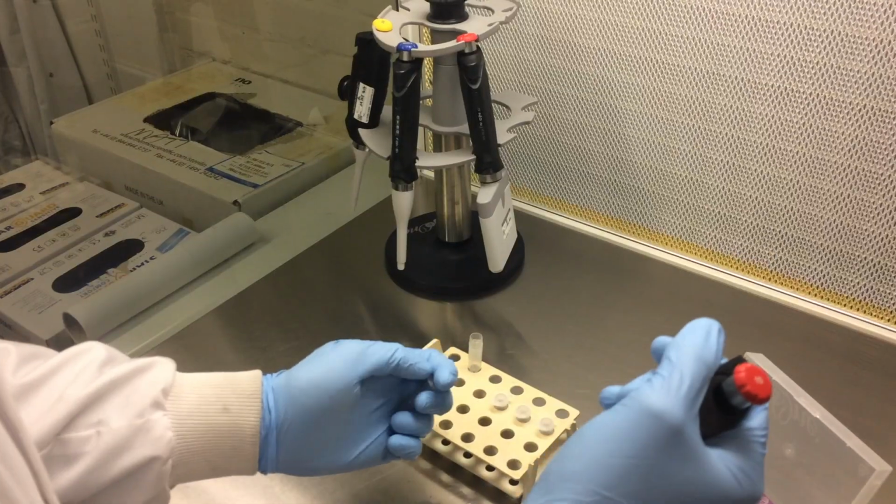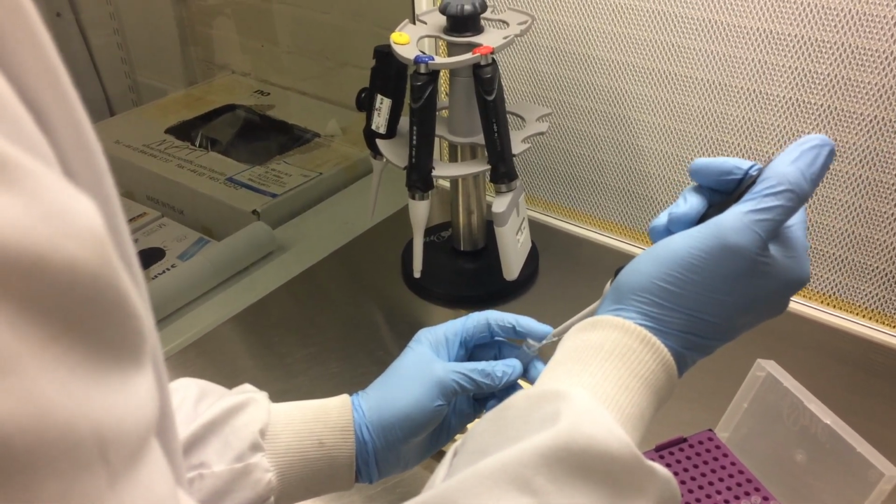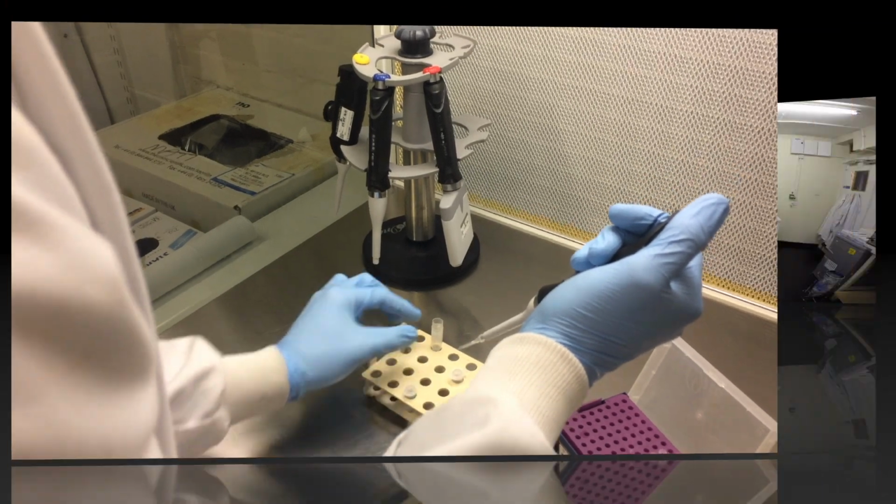The current situation with Chytrid testing is that you swab an animal, it then gets sent to a lab, and then the assay or the samples processed. Now, the whole process could be done in perhaps 2 days, but generally it's going to take longer than that. So first you have the sample, you have to then extract it. That can take varying times depending on whether it's a swab or if it's a tissue sample. That can vary by various minutes.